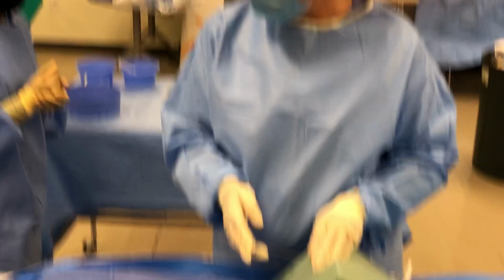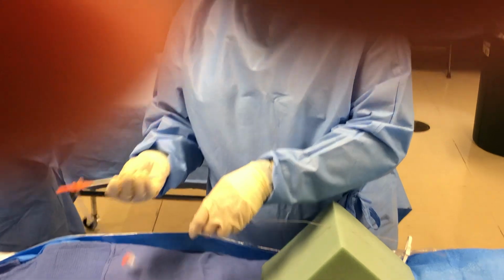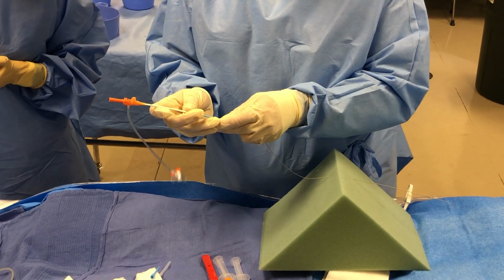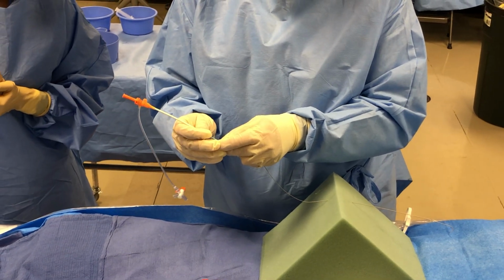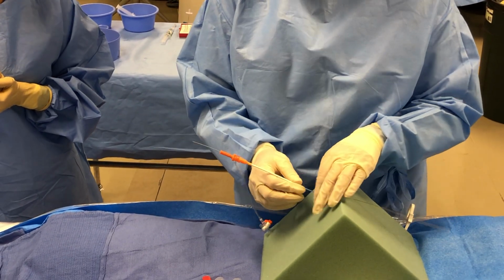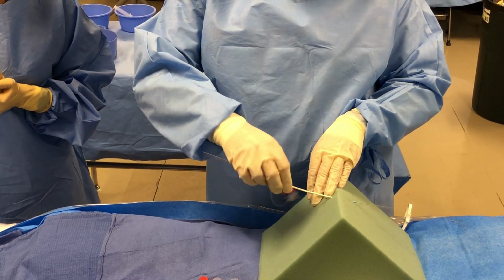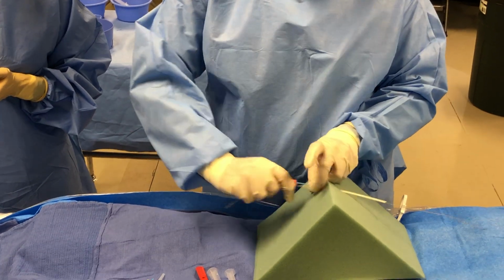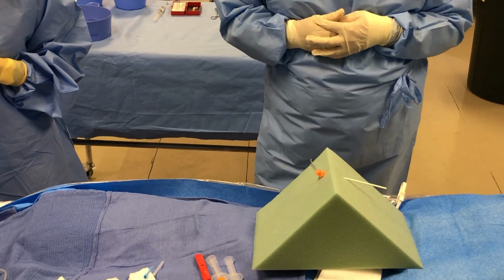Now at this point, it may be that the doctor wipes the wire, and then, because it's right here, loads. I'm hoping this might not go. Yeah, it's gonna go, good. I was hoping it wasn't a radial one. Feeding the sheath over, going in, wire and dilator coming out. Now we have our access.